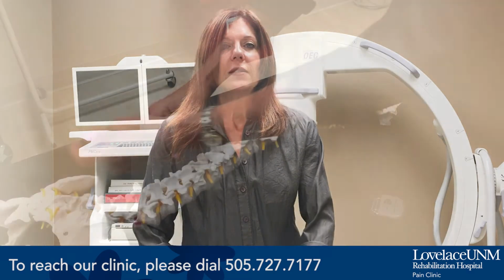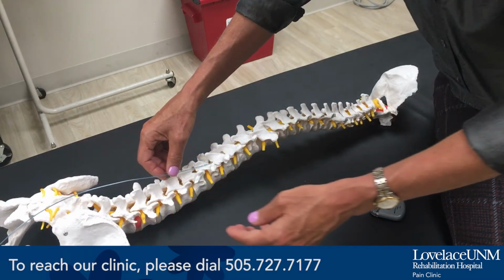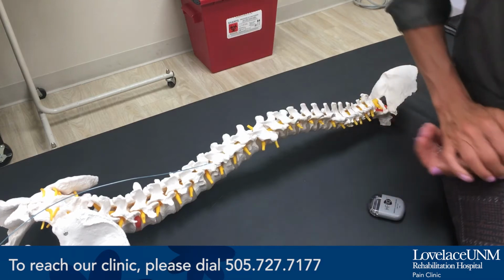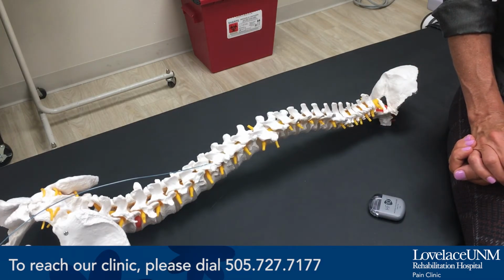One of the very nicest parts about spinal cord stimulation as a modality of treatment is that there is a trial period before one would receive the final implantation. Let's briefly review the trial. It is a 7-day period in which the patient has leads placed into the epidural space, either in the thoracic or cervical spine, depending upon whether you're targeting the neck and arms or low back and legs. The trial differs from the implantation process in a few significant ways.